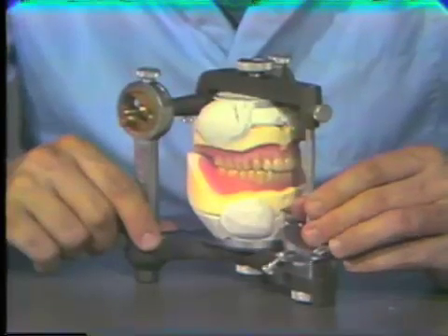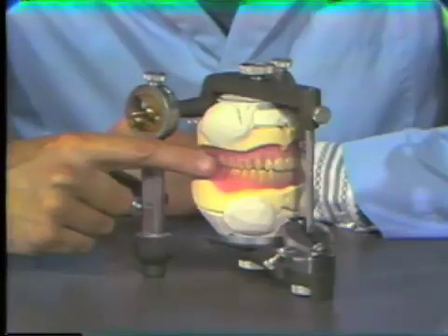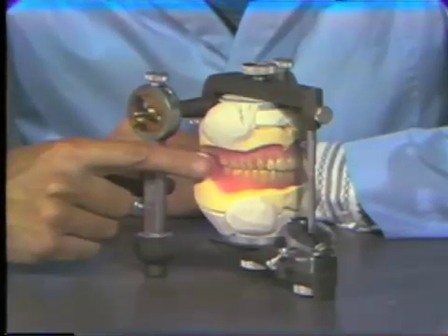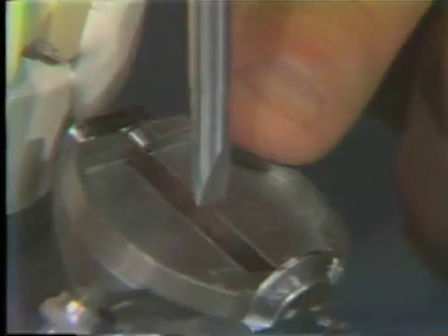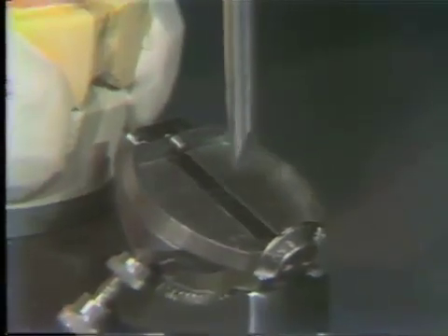Oftentimes, you will note that the posterior area is in contact prematurely. This is for two reasons. One, oftentimes the retromolar pad area and heel area are over-waxed in the wax-up, and now that it is acrylic, it is premature. Secondly, the processing procedure usually causes minor tooth movement most in the posterior area. So usually the heels or the posterior teeth will be premature in occlusion when the casts are returned to the articulator. This can also be noticed by the incisive pin position in relationship to the table — the incisal pin is about two millimeters from contact, showing that the posterior area is premature.